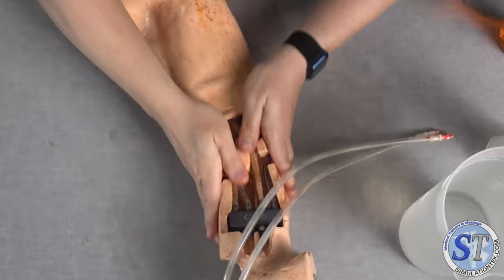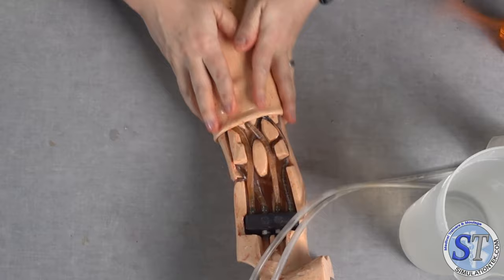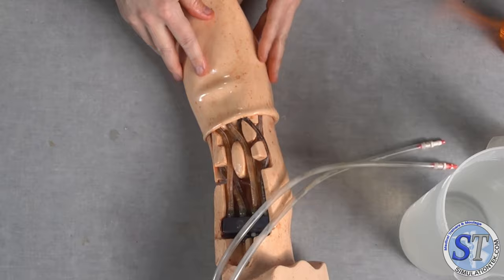And then we've got our soaps. So what we're going to do is just get some of the soap on my hand. And yeah, this gets a little messy, but it's soap, it's clean. So we're just going to coat like this, and we're going to coat going up. And have paper towels, things like that, because obviously now my hands are slippery. So as I grab back onto these, it's going to be slippery and you're going to have a big old fight. I'm going to step off and get some paper towels to dry my hands.